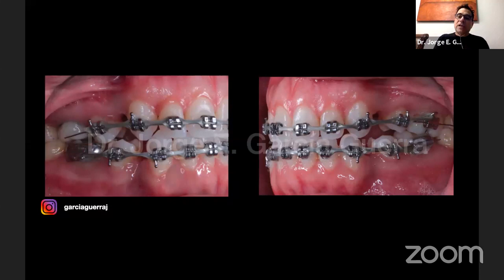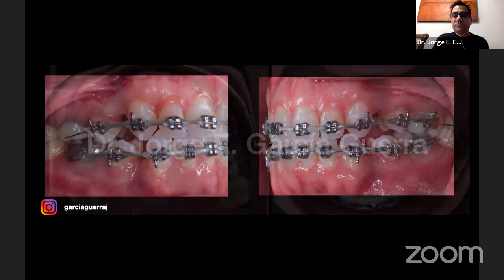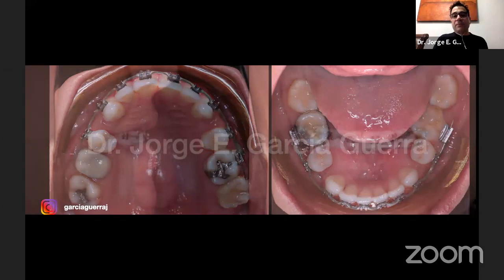Now the patient was concerned because she started to see that her canines were going into a cross bite and she started feeling the roots on the buccal. Okay, you can see the arch form, it's very triangular. And obviously, this is not a good treatment. So we took the brackets off.